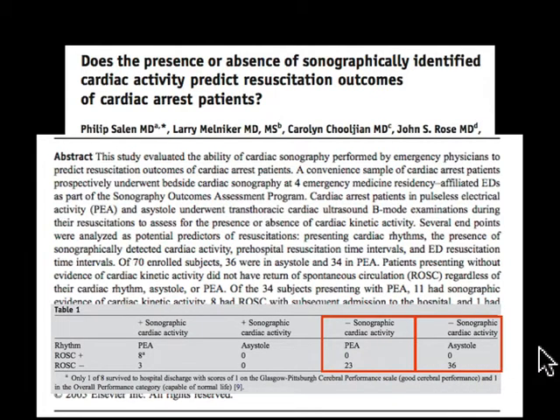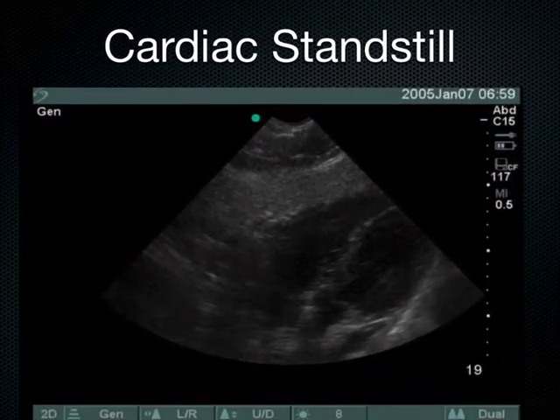There's a study going on right now. There's 61 sites. We're one of the sites looking at this exact same concept called the REASON study that Rod Mortazavi's, one of the medical students, is sort of in charge of. And so we're looking at that now as one of the many centers doing this to try to find, is there any situation in which a patient could actually survive who had cardiac standstill on their ultrasound. This is what it looks like right now.